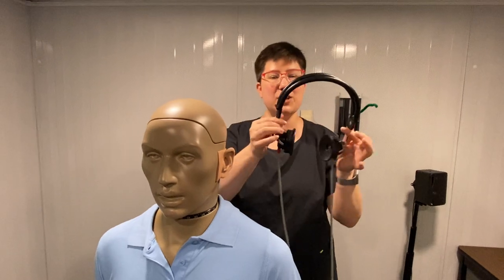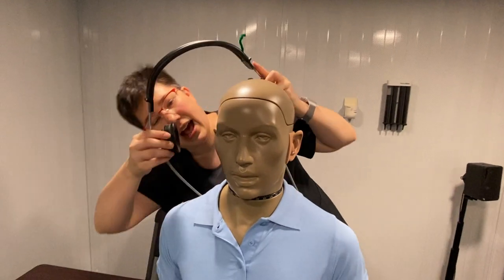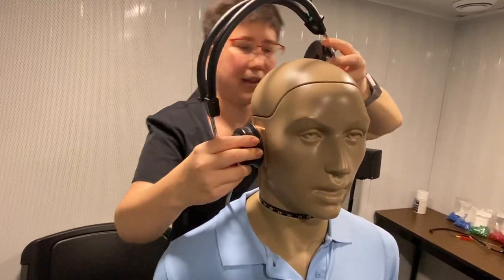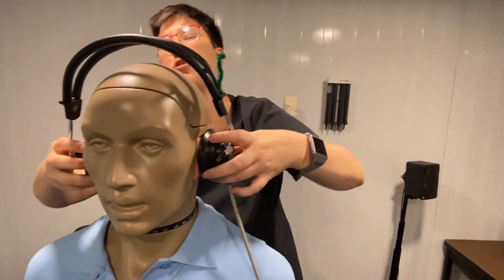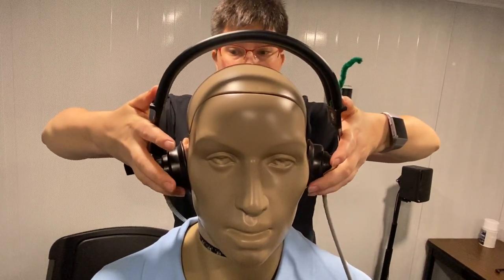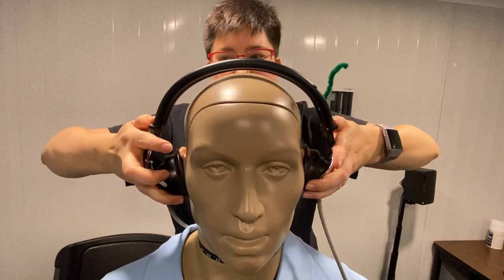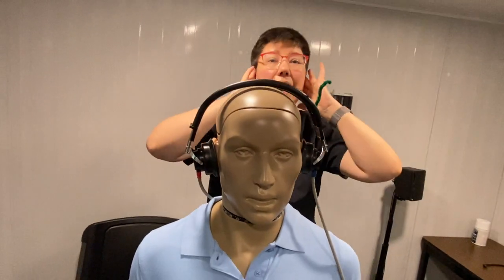You want to hold it fully extended — fully extended. Get at eye level and match the diaphragm to the ear hole. Get close and look. You see how close I am? That's how close you need to be. Then double-check that it's perpendicular to the floor. Now look at my bottom fingers — they're on the cushion, not the metal, and my thumbs are here, squeezing them together at the same time, neatly and evenly on both sides so that it draws the pinna up.